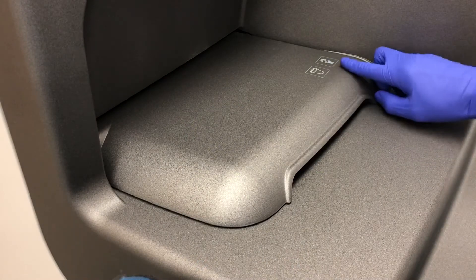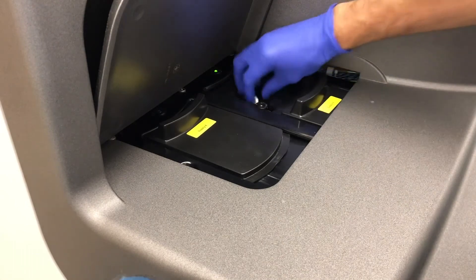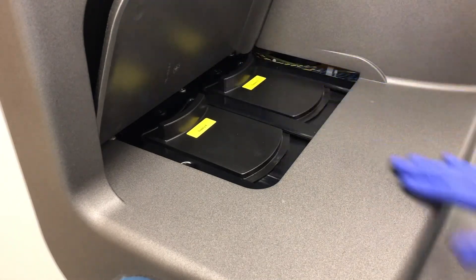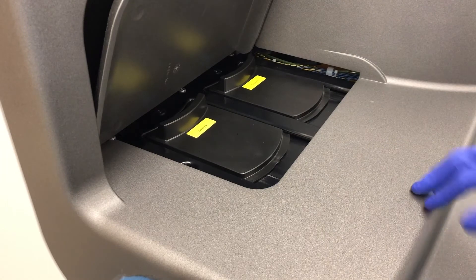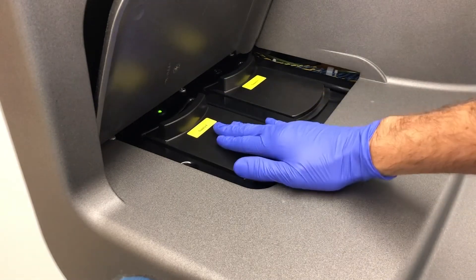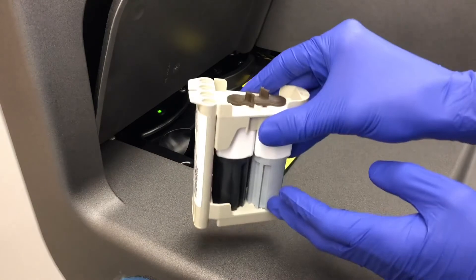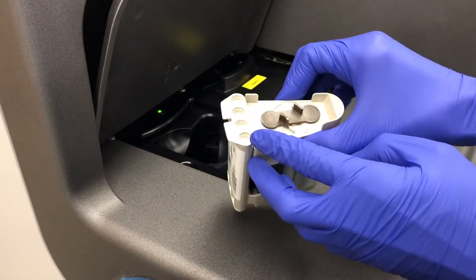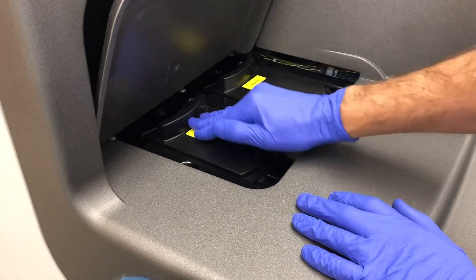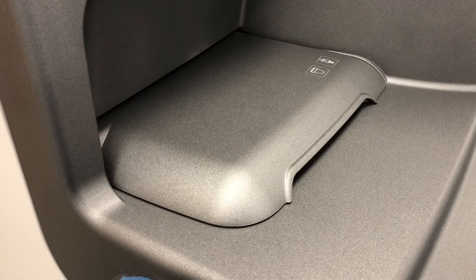Coming over to the other side of the analyzer, you have your micro-tip and micro-well — Supply 3 is your micro-tip. You can just take those out, close it, and it'll cycle to a new position. Then open it again when the light is green and load a new one. On Supply 4, it's the same thing: open it up when the light is green, add a reagent pack, close it, and it'll cycle to the next position, turning green when it's ready to be opened again.